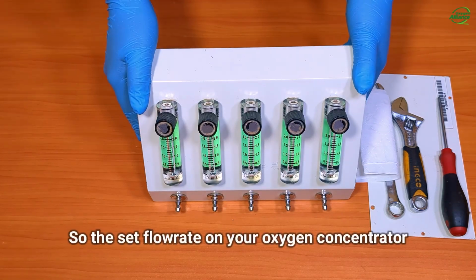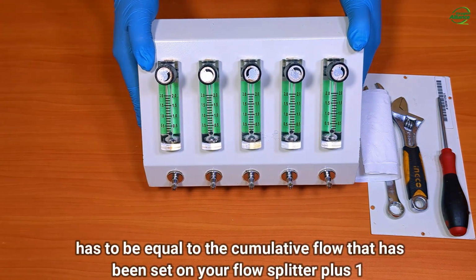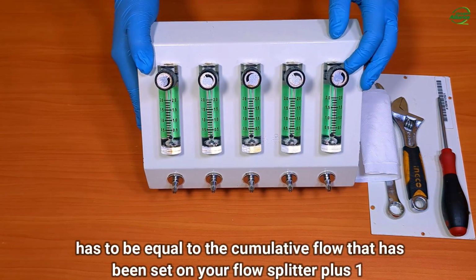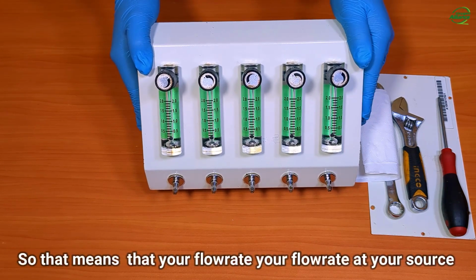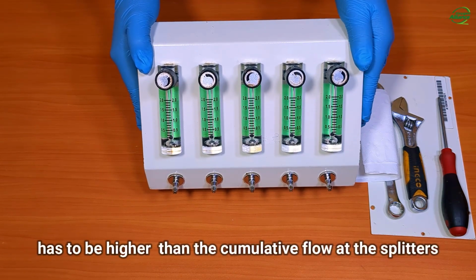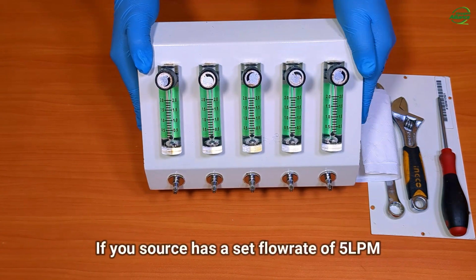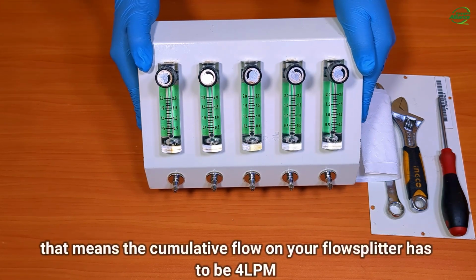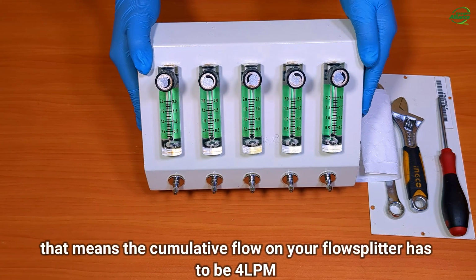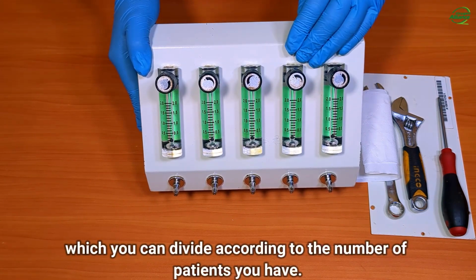So the set flow rate on your oxygen concentrator has to be equal to the cumulative flow that has been set on your flow splitter plus 1. So that means that your flow rate at your source has to be higher than the cumulative flow at your splitters. If your source has a set flow rate of 5 liters per minute, that means the cumulative flow on your flow splitter has to be 4 liters per minute, which you can divide according to the number of patients that you have.